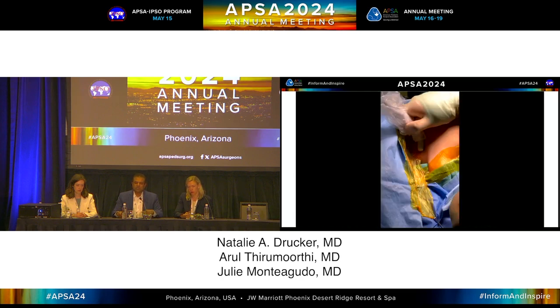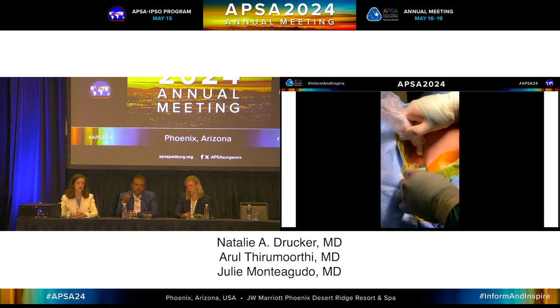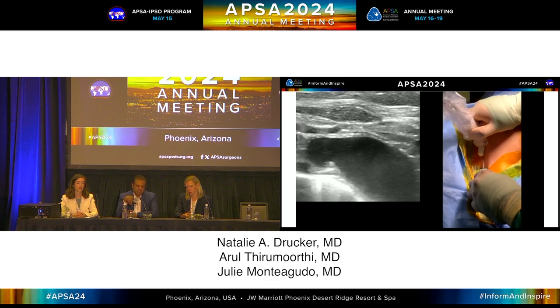All right, so this is a slightly larger patient, but easier to show. You can turn your probe either way. This one is showing it off the toe for the purposes of, actually, I'll let you guys watch this now. Okay, so that's this subclavian IJ junction.